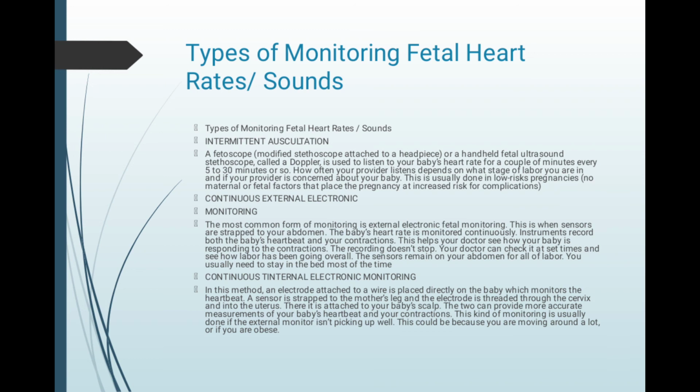The recording doesn't stop. Your doctor can check it at set times and see how labor has been going overall. The sensors remain on your abdomen for all of labor. You usually need to stay in the bed most of the time.